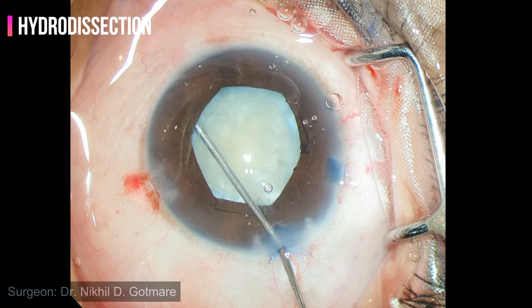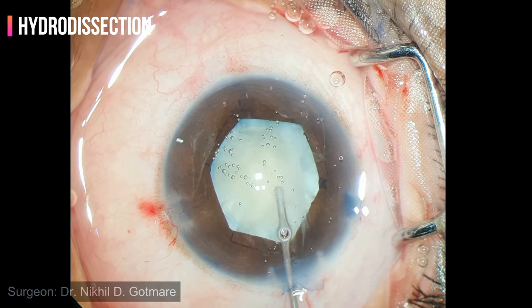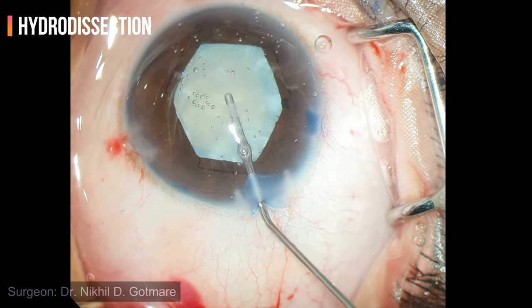Hydrodissection is done. It is important to tap on the nucleus in between to avoid posterior entrapment of fluid. Nucleus rotation is achieved.